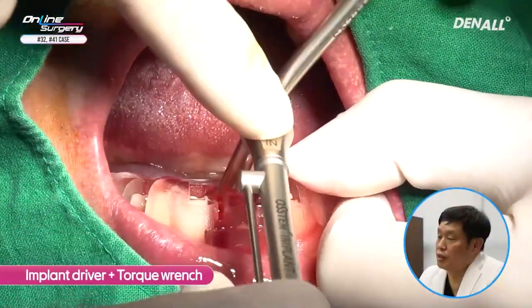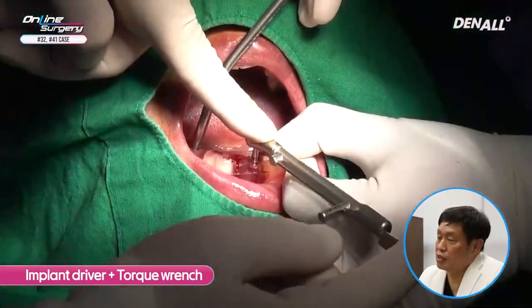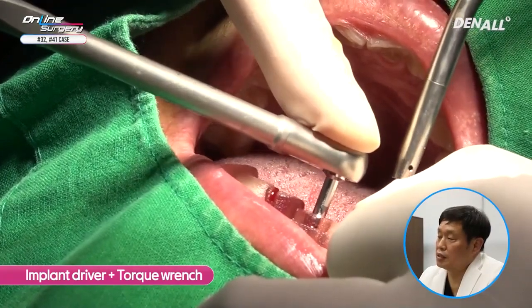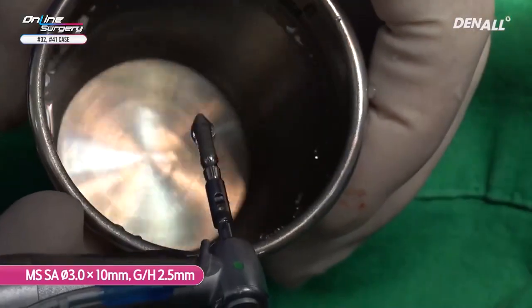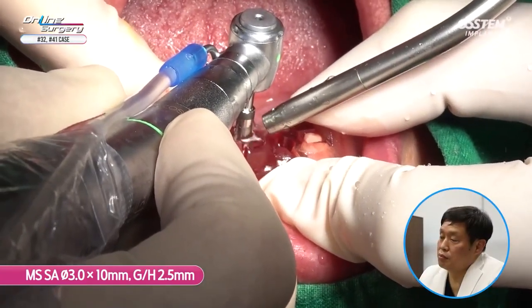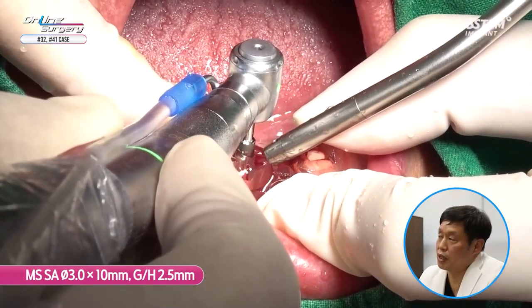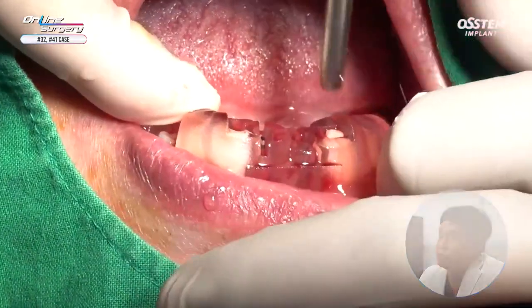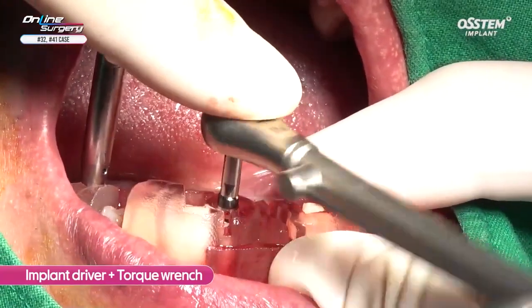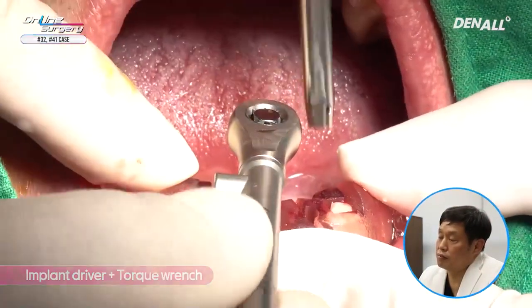I am using a hand wrench and implant driver to get the implant into position. As mentioned earlier, gingival height was 2.5, so you need to go up to the highest point of the laser marking, which is in black. Primary stability is around 30. The implant has been placed nicely. MS 3.0x10 mm with gingival height 2.5 is being placed in number 41. I am placing it approximately 70–80% using the NGIN. Gingival height is 2.5, therefore you need to do it up until the top. And you can see the torque here.